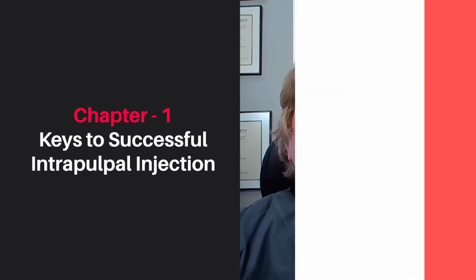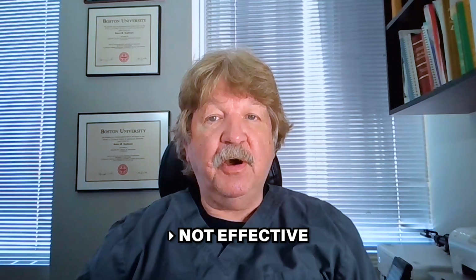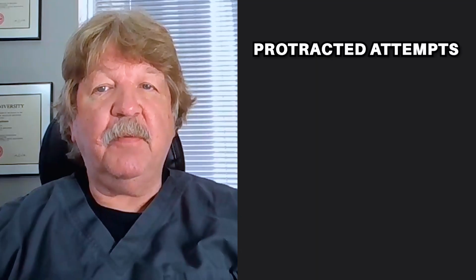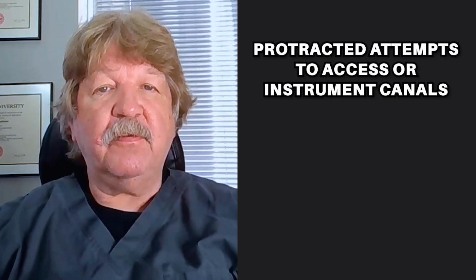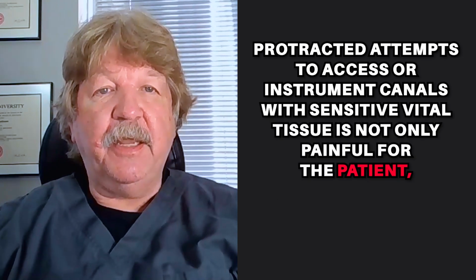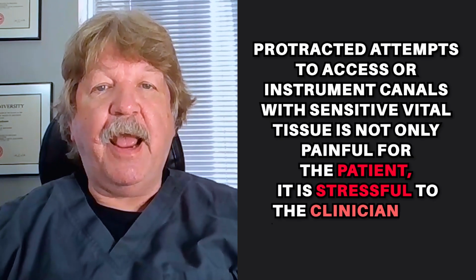It is my opinion that intrapulpal anesthesia is a much preferred method over repeated, unsuccessful injections that are not effective and serve only to make patients' soft tissues uncomfortable after the procedure. Protracted attempts to access or instrument canals with sensitive vital tissue is not only painful to the patient, it is stressful to the clinician and especially to their staff. You're much less likely to create an optimal endodontic treatment when the patients are jumping around because they're uncomfortable.